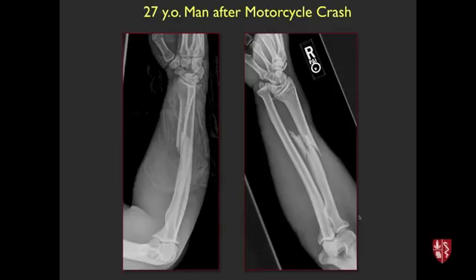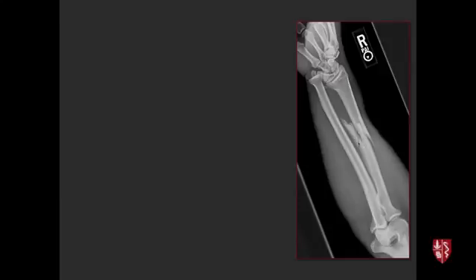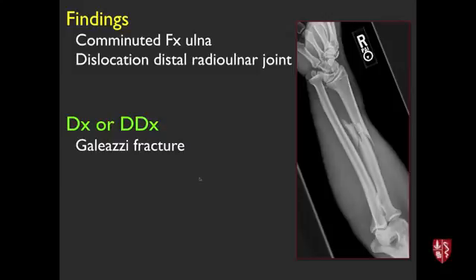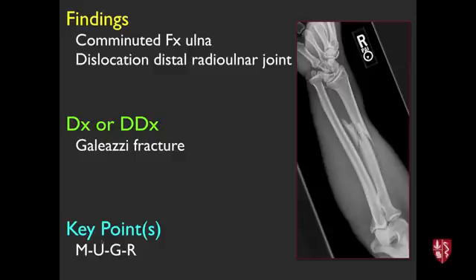Next case, 27-year-old man after a motorcycle crash. There's a fractured radius, and additionally a dislocation of the distal radioulnar joint — the ring concept. This is a Galeazzi fracture. Remember: Monteggia goes with the ulna, Galeazzi with the radius. That's a convenient mnemonic to remember these eponyms.